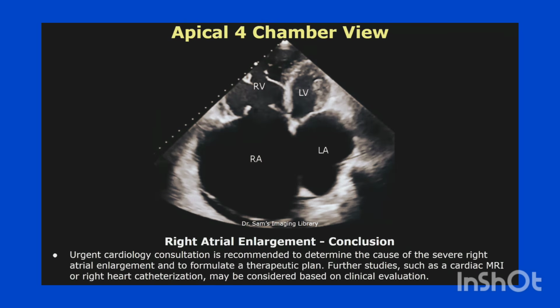Urgent cardiology consultation is recommended to determine the cause of the severe right atrial enlargement and to formulate a therapeutic plan. Further studies such as a cardiac MRI or right heart catheterization may be considered based on clinical evaluation.